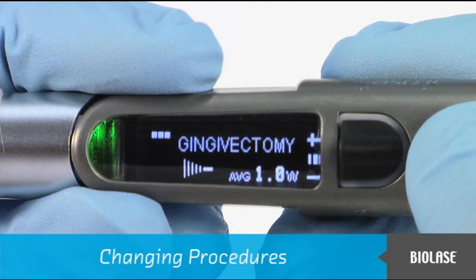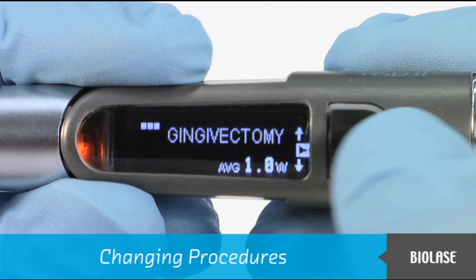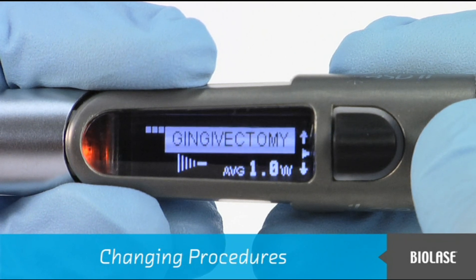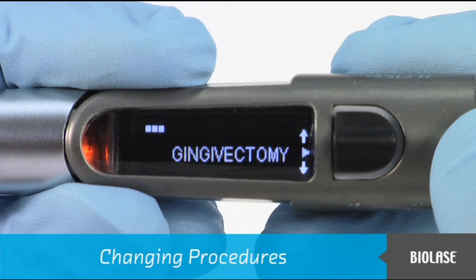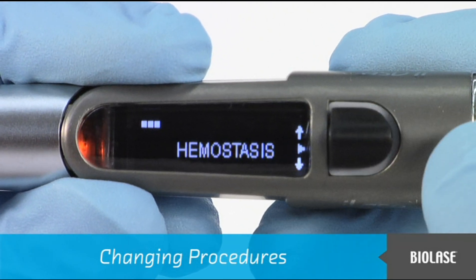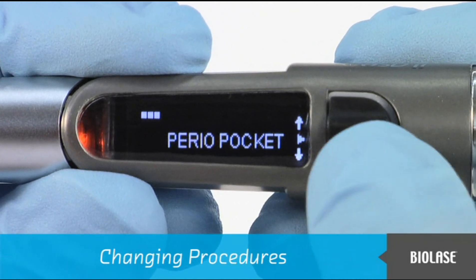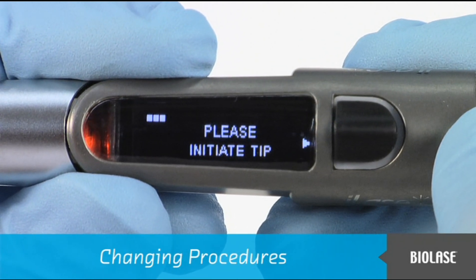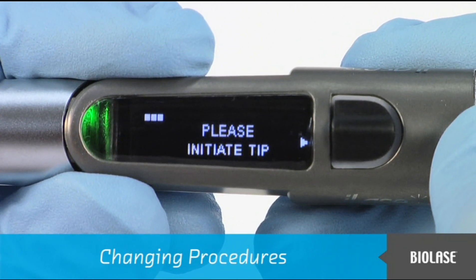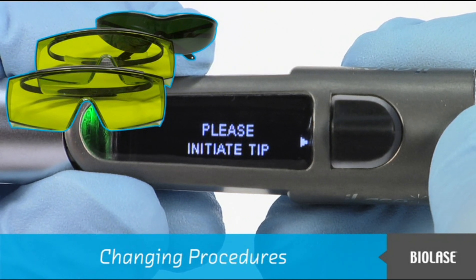To change procedures, first enter standby mode. Then push the black navigation button up or down until the name of the procedure is highlighted, and press the navigation button in. The select procedure screen appears, and pushing the navigation button up or down will present the different procedures available. Pressing the navigation button in will select the new procedure and also place the system into ready mode, as indicated by the green LED and the red aiming beam. Please ensure that everyone in the room is wearing the appropriate eye protection.